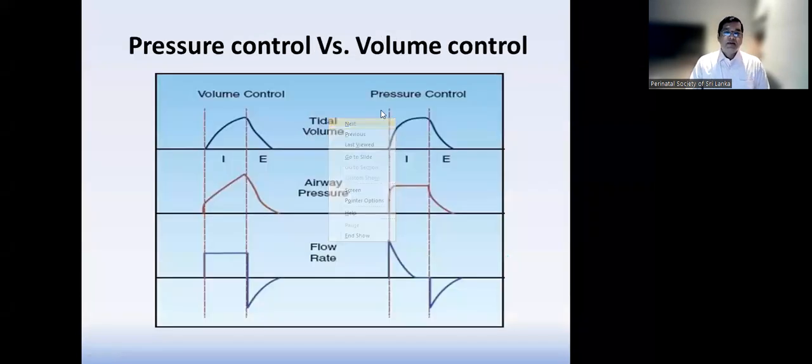Right. So මේක ඒකම තමයි pressure control versus volume control. Volume control එකේදී සාමාන්‍යයෙන් volume control එකේදී pressure change වෙන විදිය pressure control එකේ ලොකු වෙනසක් නැහැ. But volume change වෙන tidal volume change වෙන විදිය ලොකු වෙනසක් නැහැ. නමුත් එයාගේ pressure change වෙන විදිය පැහැදිලි වෙනසක් තියෙනවා.